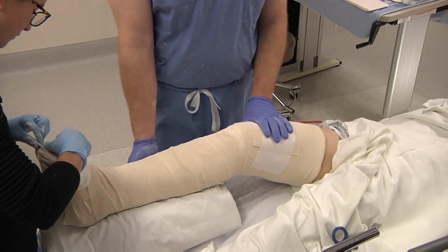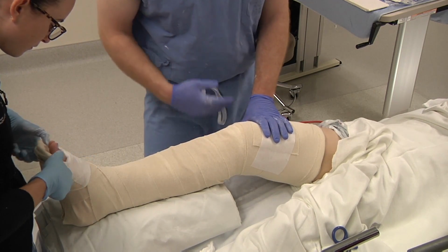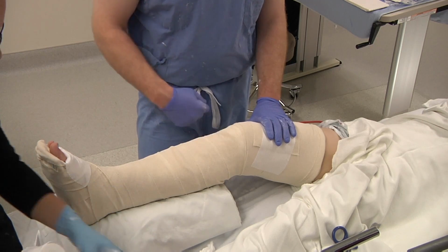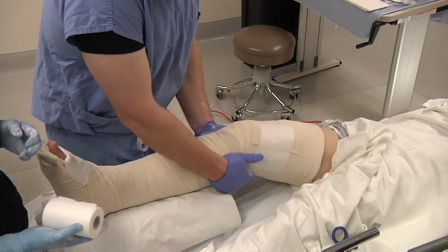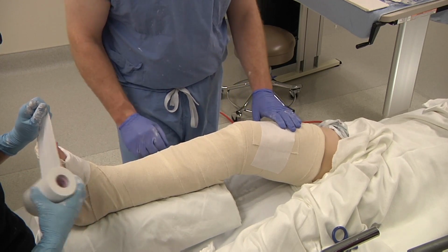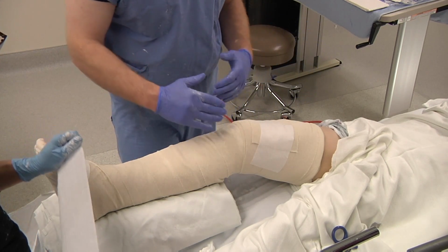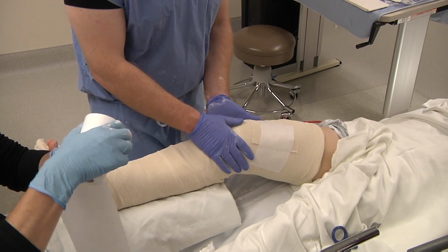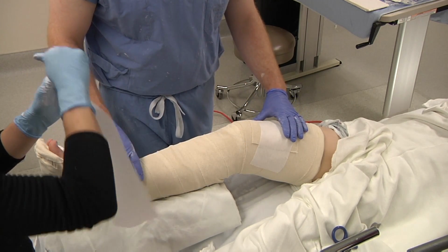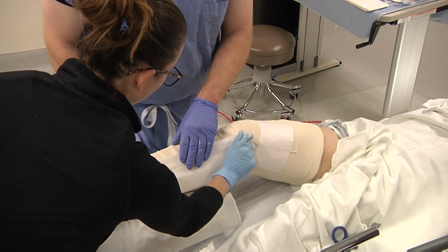Usually after this, the patient goes up with a stack of towels underneath them because, especially in a heavy leg, they will break through the laminations. So extra care should really be taken in a combative patient. Sometimes gently immobilize the legs with pillows so that they're not rolling, twisting, stressing the splint too much. And from here we secure the bias with tape.